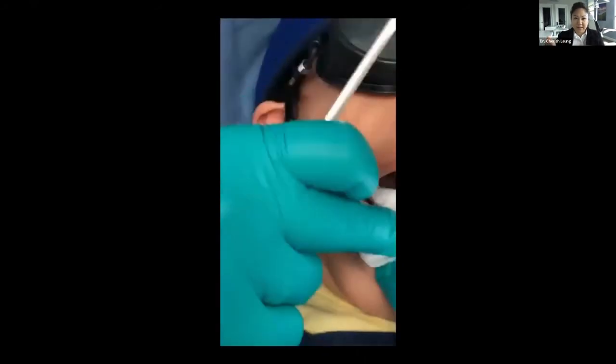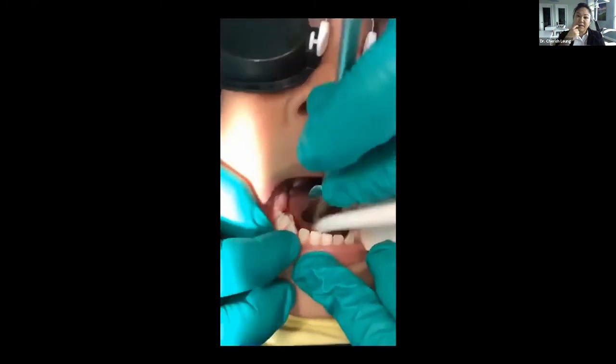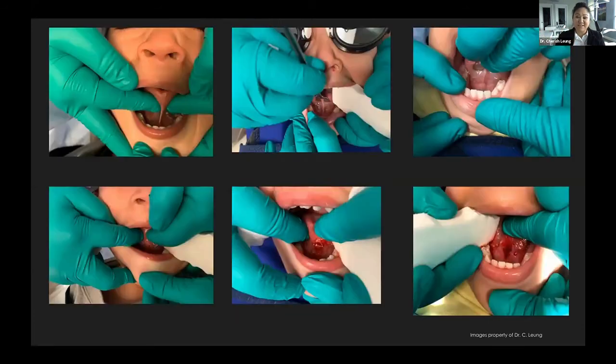Again, I just keep gauze on hand because sometimes when they're moving a lot, you get a little more heme than you want. And that's okay though. Right after, we just use the laser on the laser bandage setting, and that causes hemostasis. Again, done already, super fast.